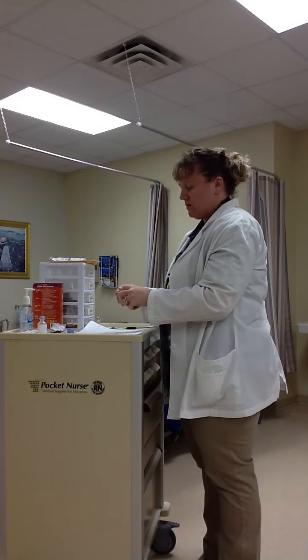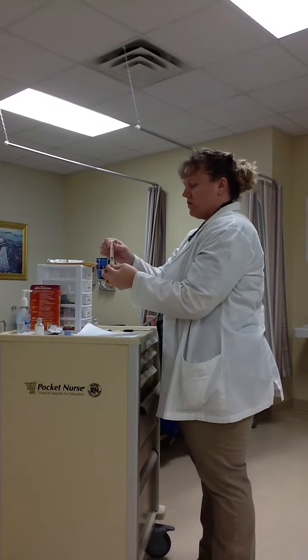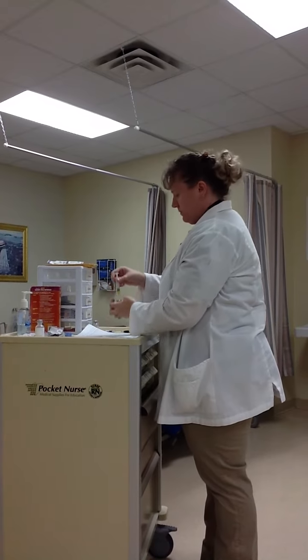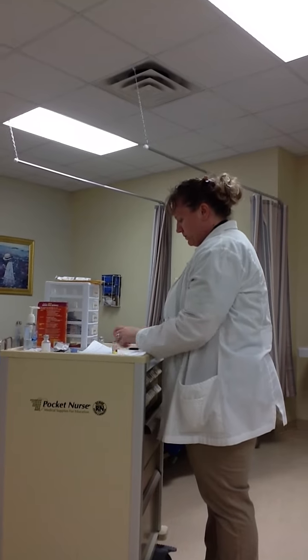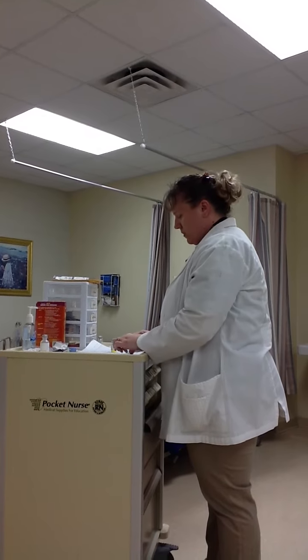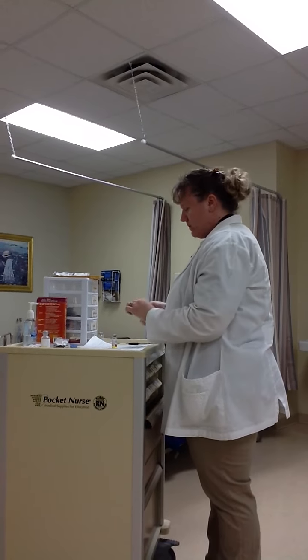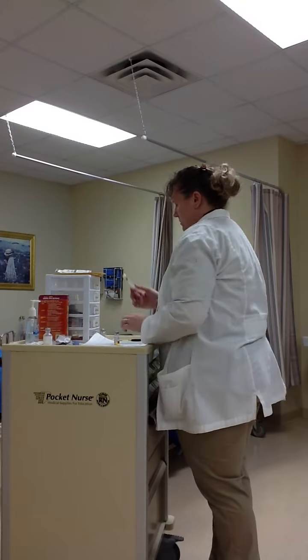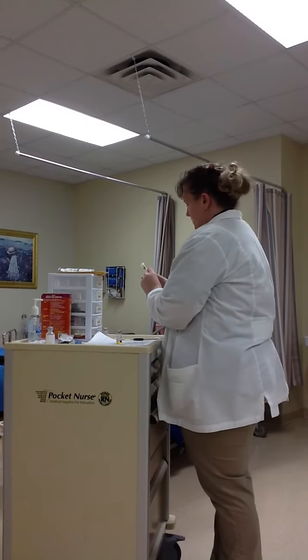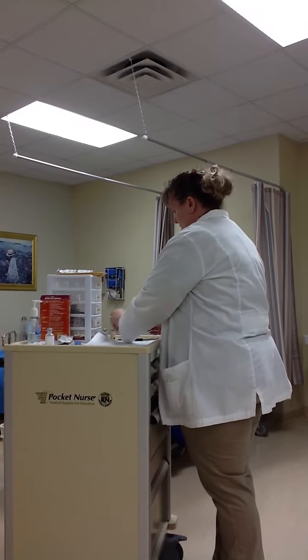If you happen to have that happen, my needle came out, you will take it, screw it right back in. Okay? I'm going to get rid of this needle anyway, because it has gone through that stopper and I don't want to go to my patient with a dull needle. So I know that this is 0.5 mLs.